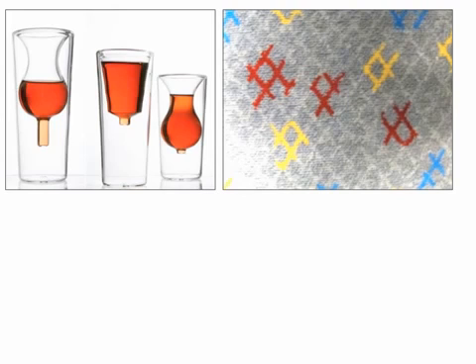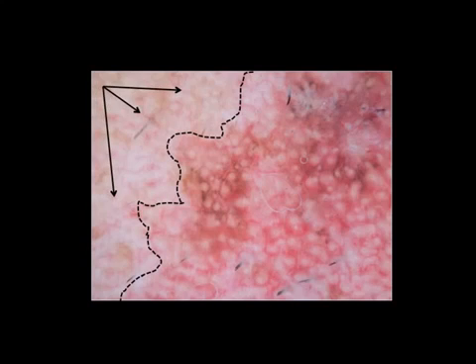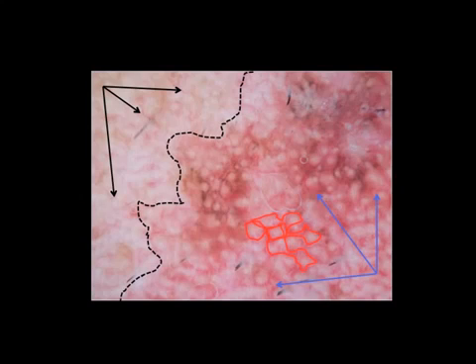In some cases it's possible to observe both signs. In this case, for example, the vessels are very different outside and inside the lesion, but the vessels inside are not only more dense — they have a lozenge shape and form red rhomboidal structures.